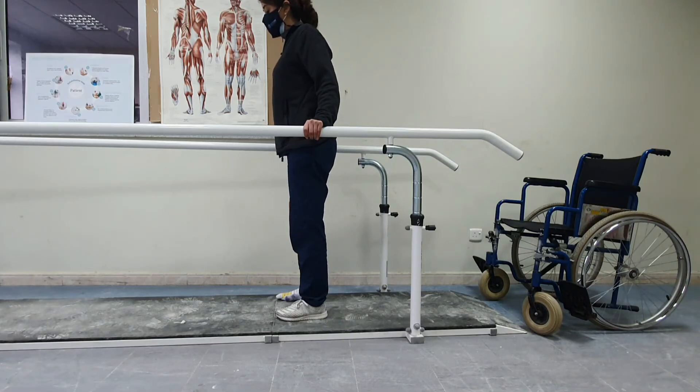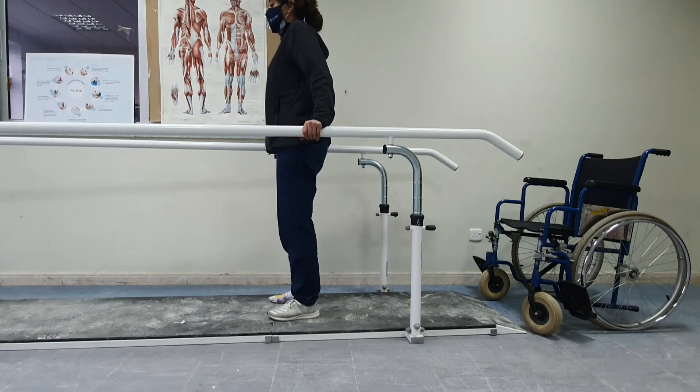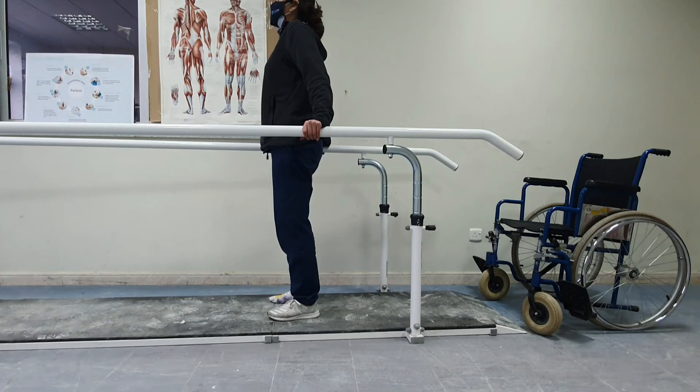Next, the patient needs to learn to do push-ups by pushing on the parallel bars and lifting their legs off the ground. Some patients may use the head-hip relationship by ducking the head down to lift the pelvis.